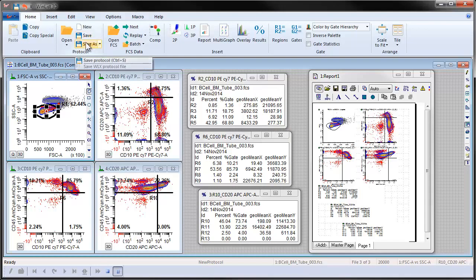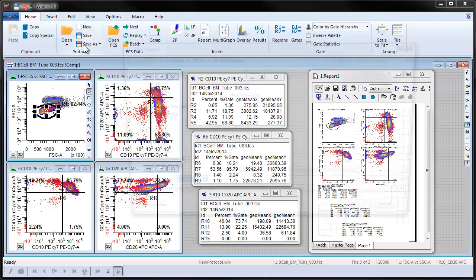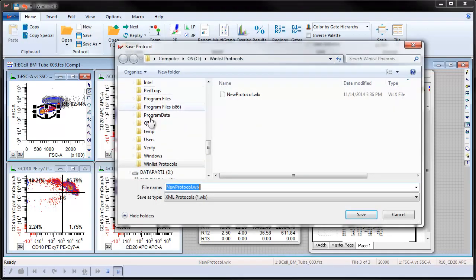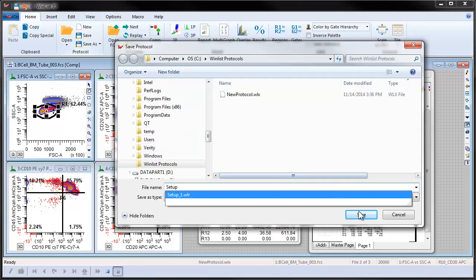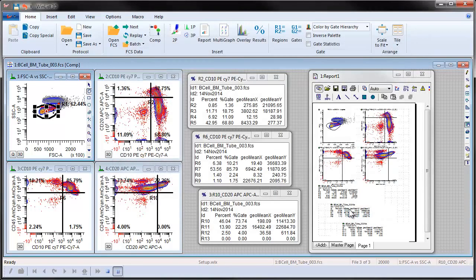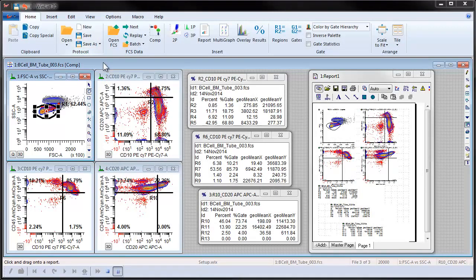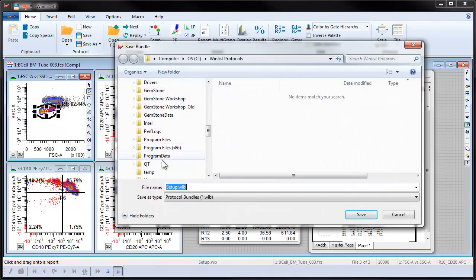This would be a good time to save the protocol, which will allow you to recreate your complete analysis setup whenever needed. It is often preferable to save it as a protocol bundle, a self-contained version of the protocol that can easily be shared with other WinList users.